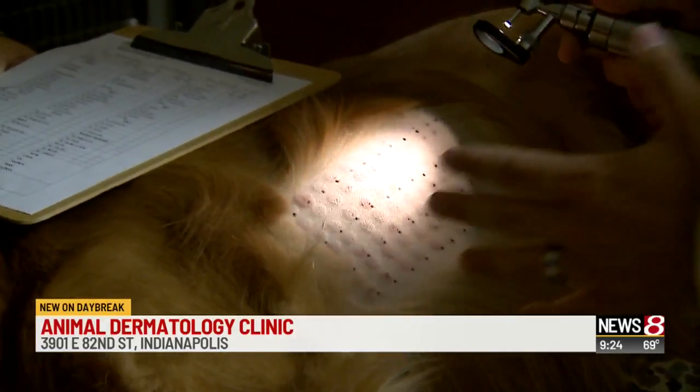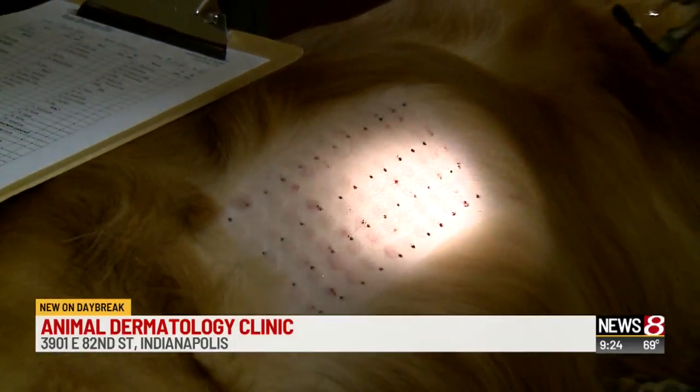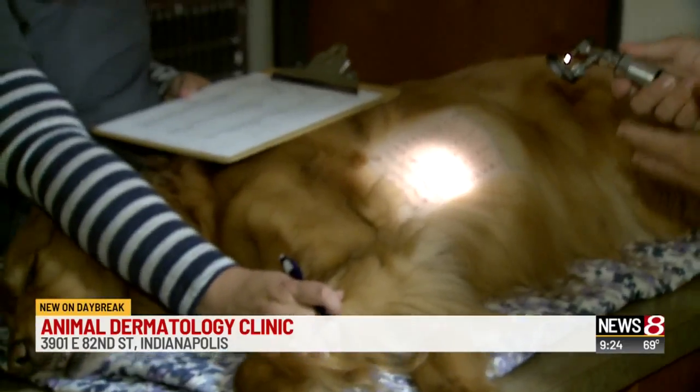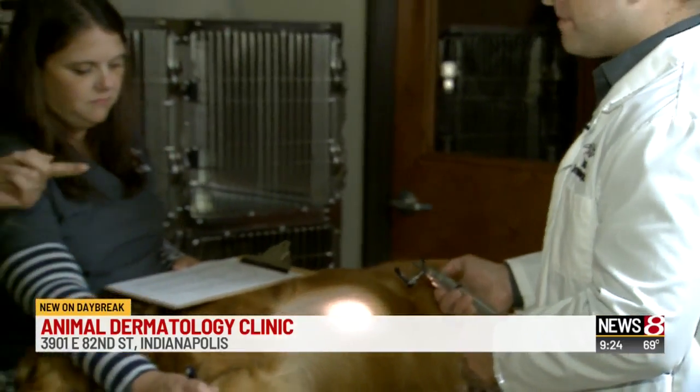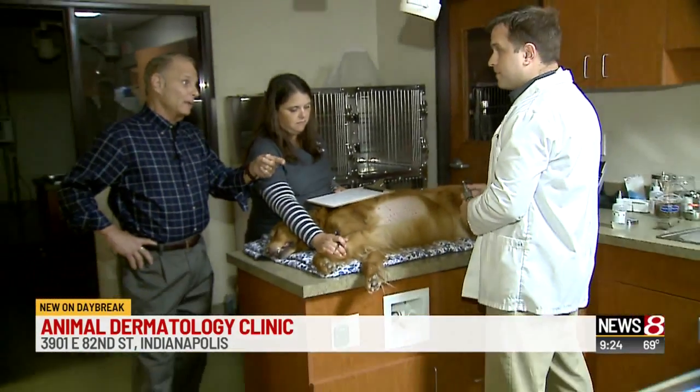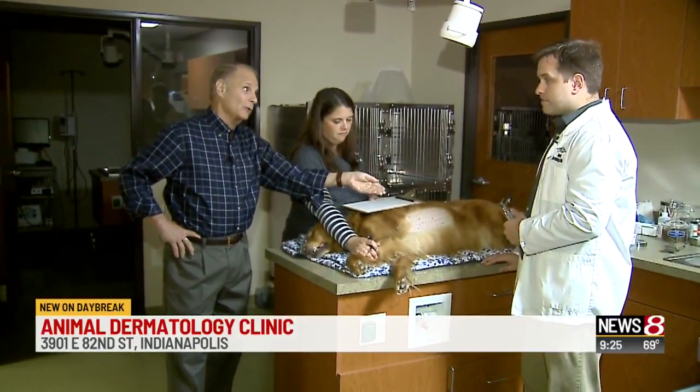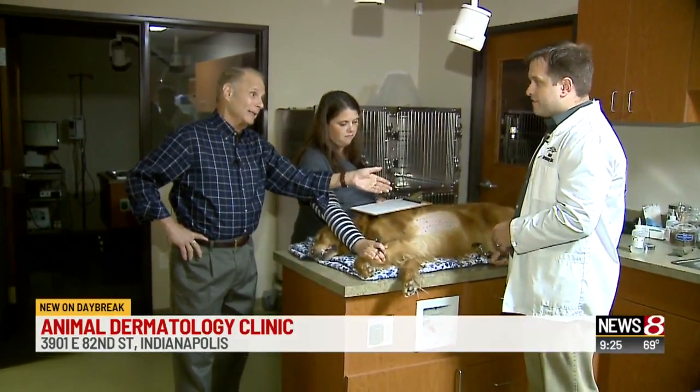And so she has a very nice test with several positives, and we will record those and use those to formulate a therapy to desensitize her immune system. Let's jump ahead 10 or 15 minutes, see that Emmy is okay, and talk about what you would tell the owner, who actually works here at the clinic, about what to do to deal with the allergy.